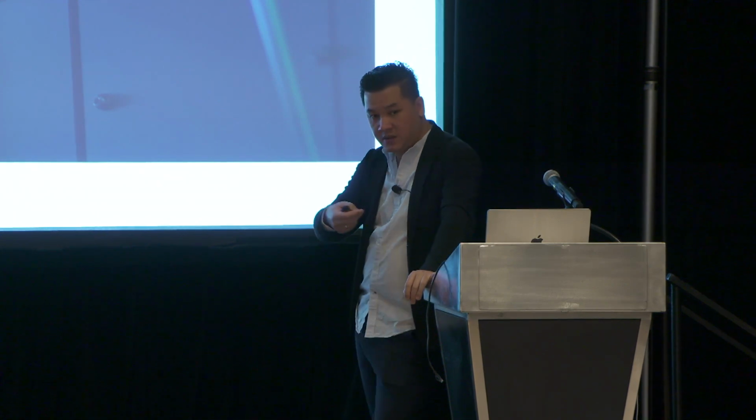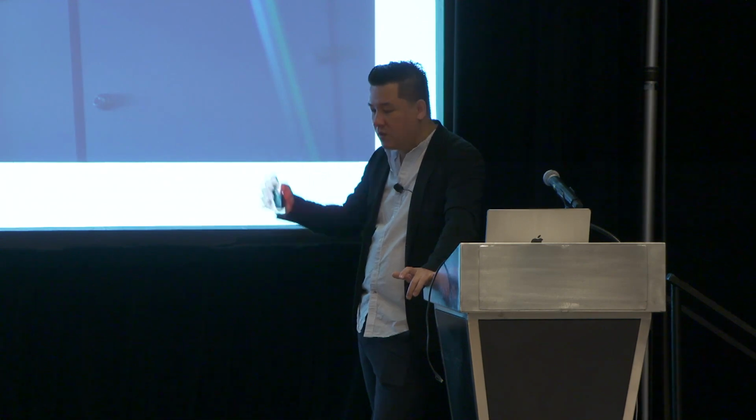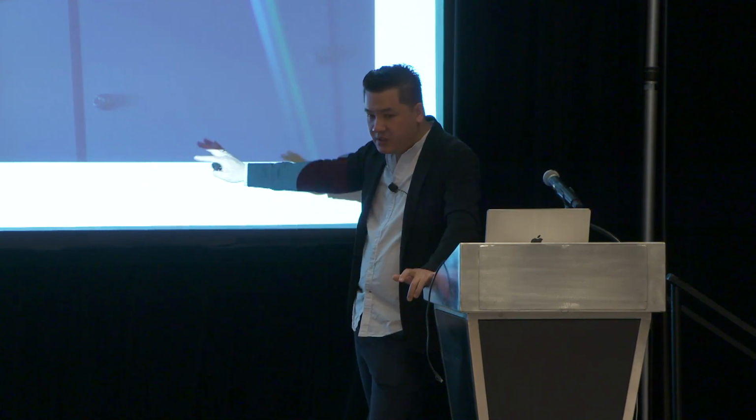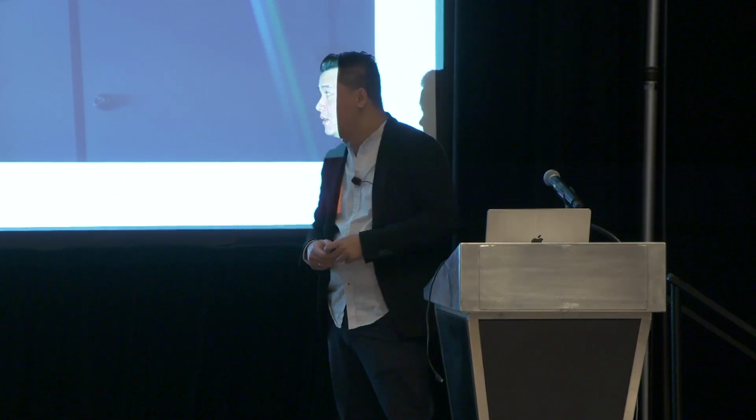Provisionals, obviously, little tiny temporaries. If they want marginated temps, they can send you a scan. We do those occasionally, but that's kind of more for chairside, right? So if you work chairside or you're in an office, printed provisionals are great because you can design them pretty quickly off CAD software by mirroring what's already there existing, and then it's printing for you while you're doing other things or attending to other patients rather than manually trying to adapt a temporary.